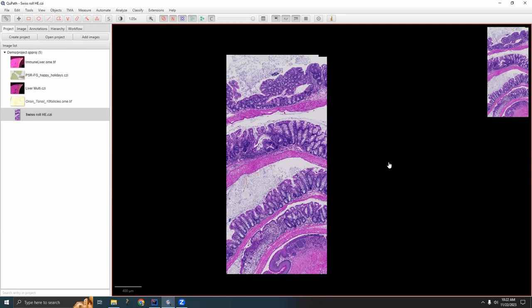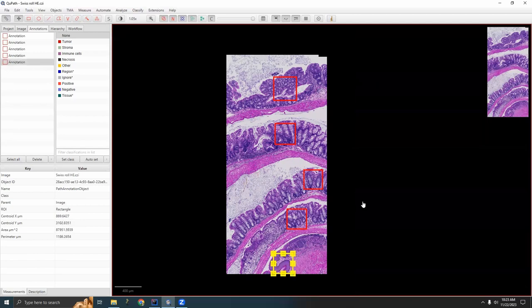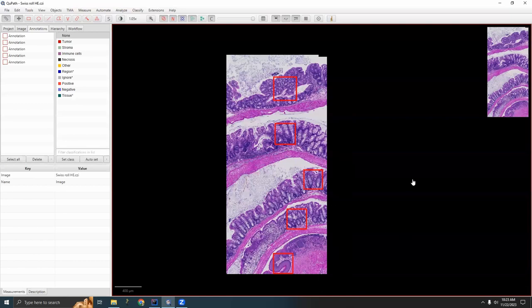This is a crop of an H&E stained Swiss roll. And let's say I wanted to mark a couple of regions, one on every layer of the intestine, and export those regions to view elsewhere. The first thing I'm going to do is just draw some rectangles. For the moment, it doesn't exactly matter where, but obviously on your project, you're very much going to care about that. And then the first thing I want to do is actually name these regions.